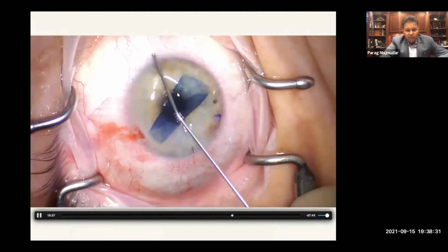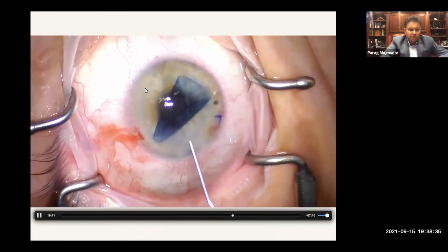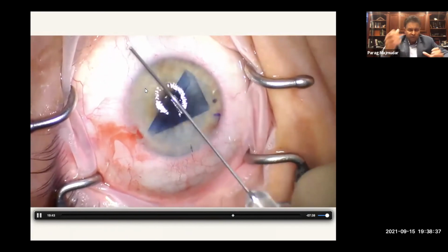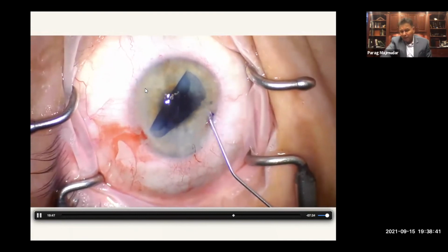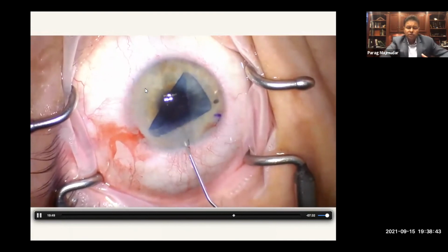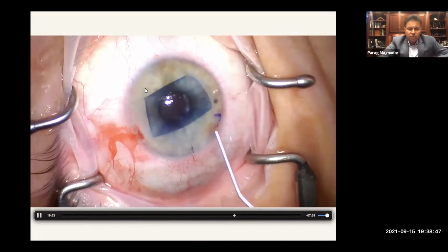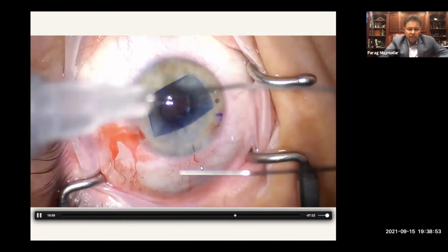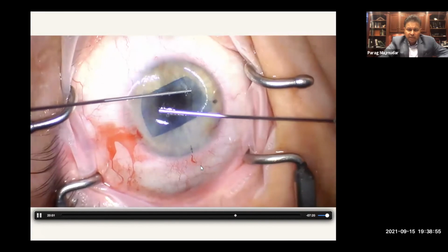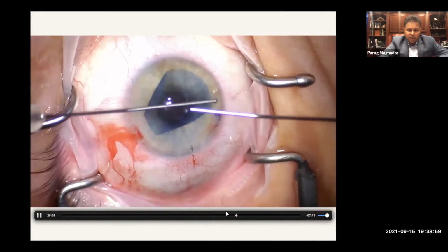So the reason I like the S stamp is that there are times where you think, oh, this is definitely right side up, but it may not be. And sometimes it's an illusion. Sometimes maybe the graft is folding in a different way too. And the way that you know that is because when you had the S stamp, they know it's on the stroma. So you're absolutely 100% certain, and that's what I'm going by. And I just feel like that's, for me, the best indicator to have, that S stamp. So you can see now here that the stamp is in the right configuration.